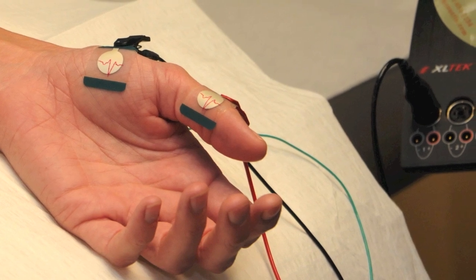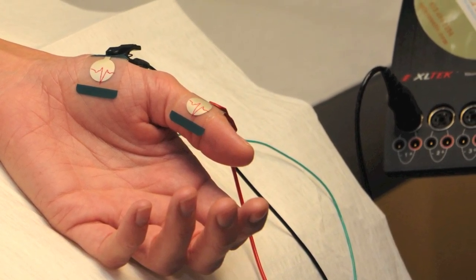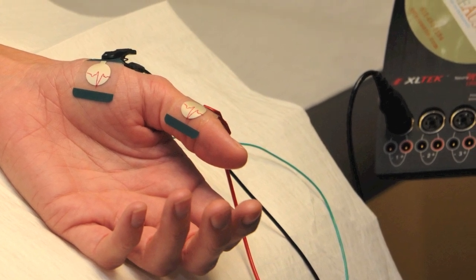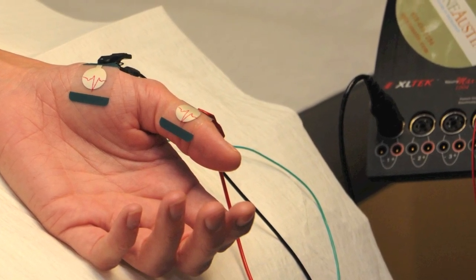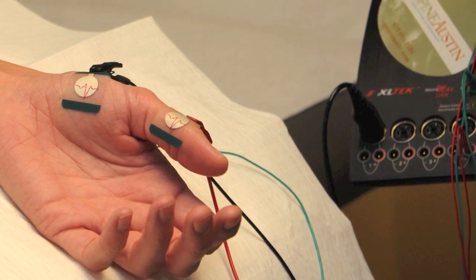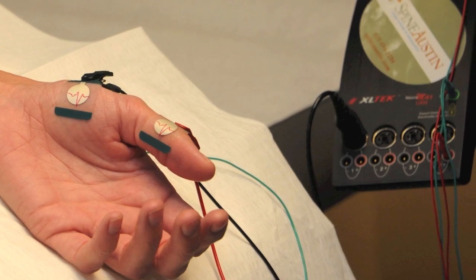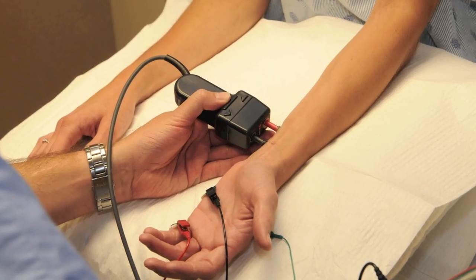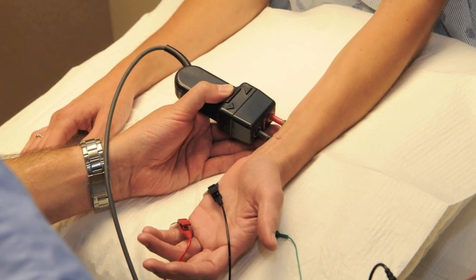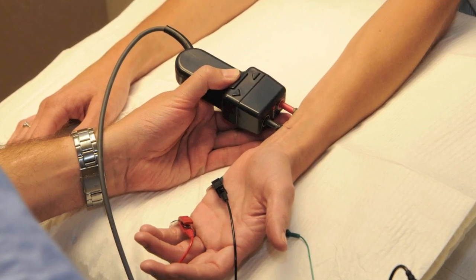Nerve conduction studies are usually performed first. The physician will place electrodes in predetermined areas of your arm or leg. A tiny electrical impulse is then delivered, testing the strength of the signal and the time the signal takes to get from one point to the other. You'll feel a small electrical impulse similar to a static shock.